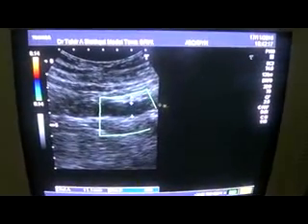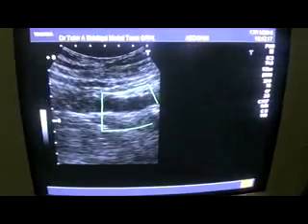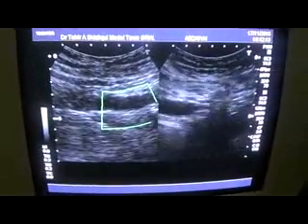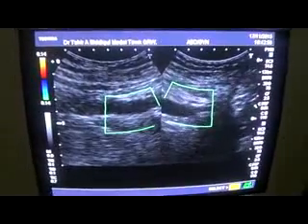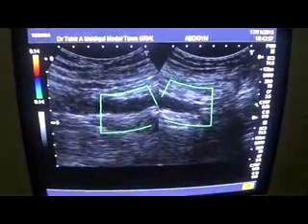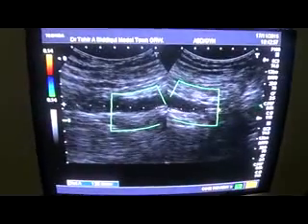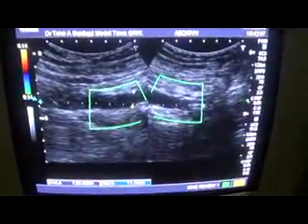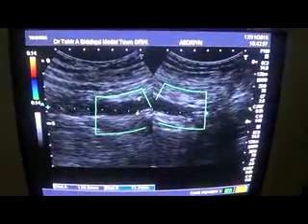This is debris within the right ureter, which is seen dilated, and then moving further down here. See, this is the length of the ureter that is traceable. Is this a vessel or is it a ureter? So this is a ureter. We can trace the whole length of the ureter. See, from here to here, it measures 12.0 by 11.7, averaging 11.7. So this is the status of the right ureter.